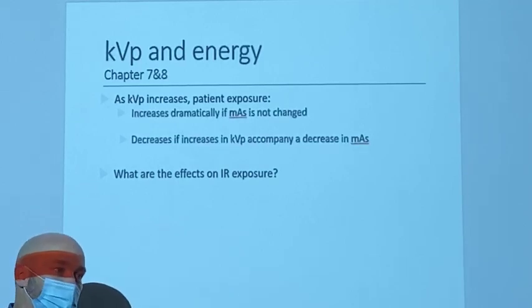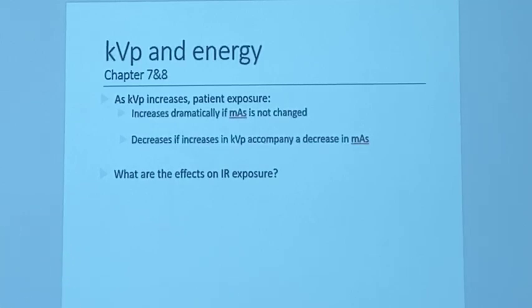So now there are 3 different ways you have to pay attention to this. One is dose to the patient. KVP goes up, and that's all you do.